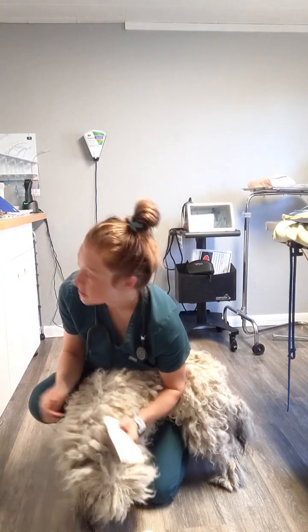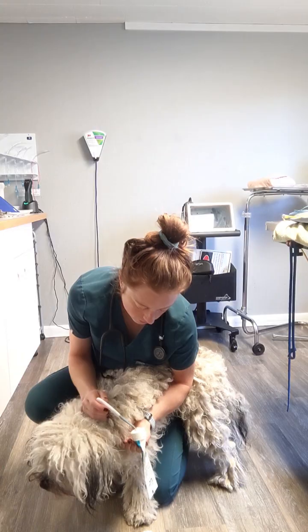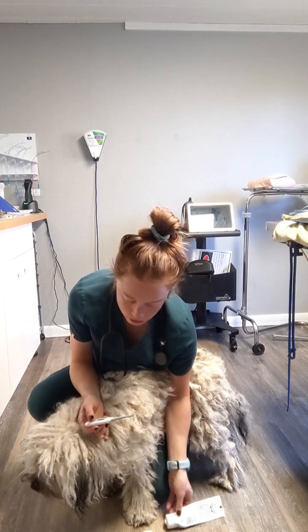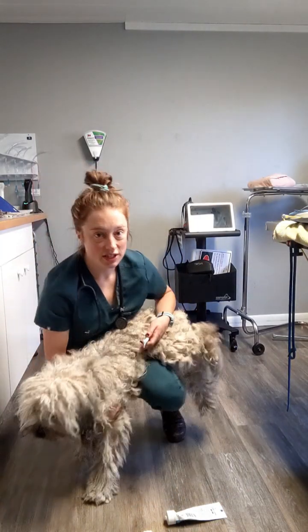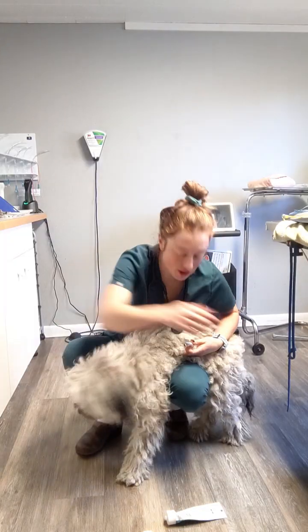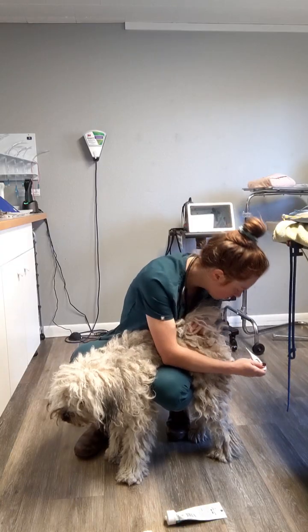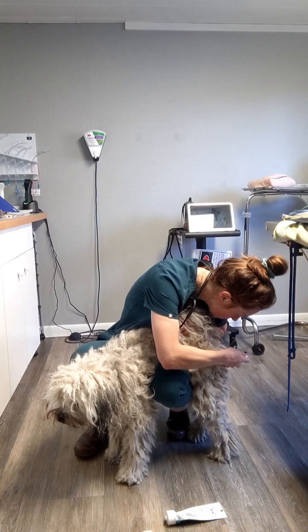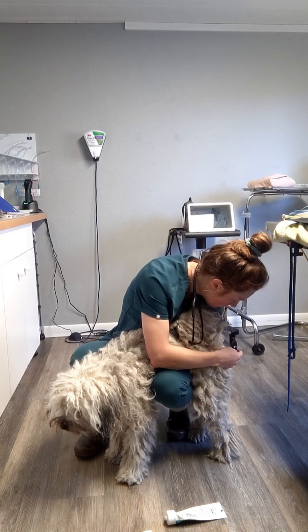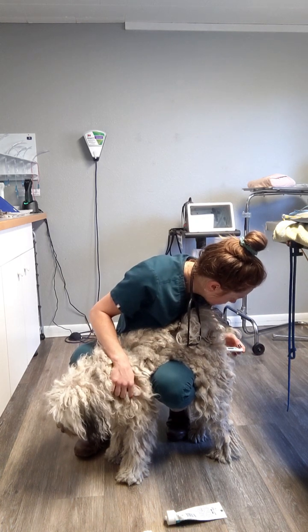Last thing I'm going to do for her TPR is check her temperature. You can come in. Put some lube on the thermometer. And when I'm doing this by myself, I like to secure them underneath, just with my knee underneath their body. Temperature is 100.7, which is normal.